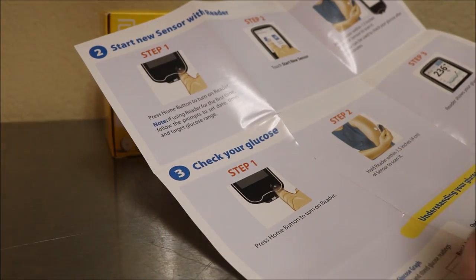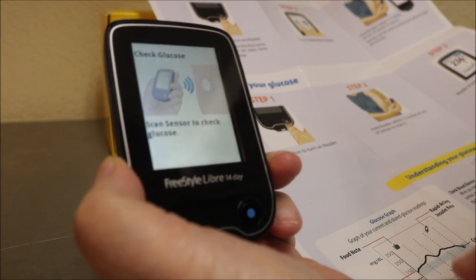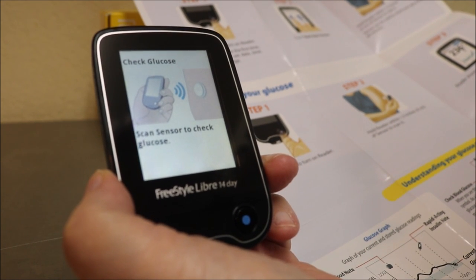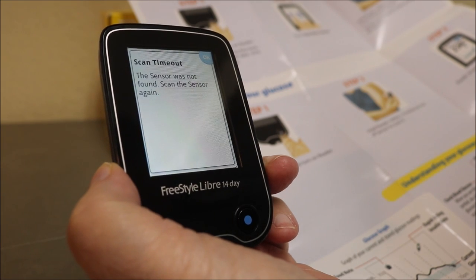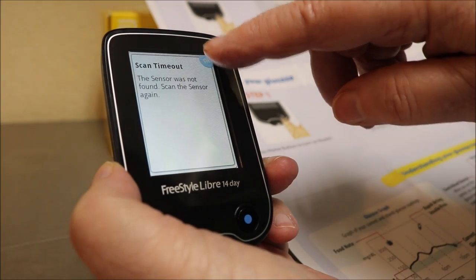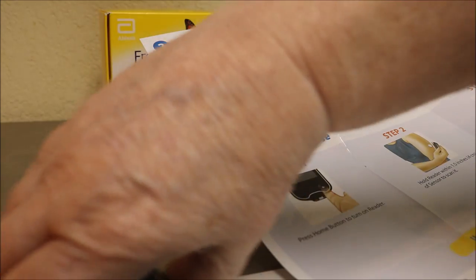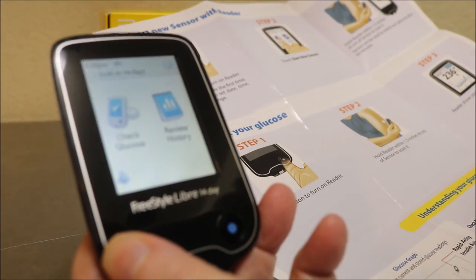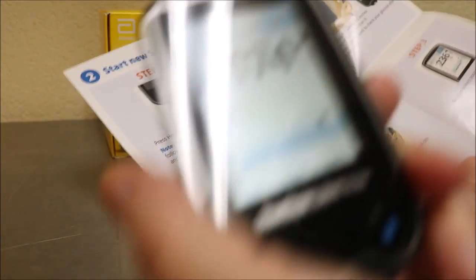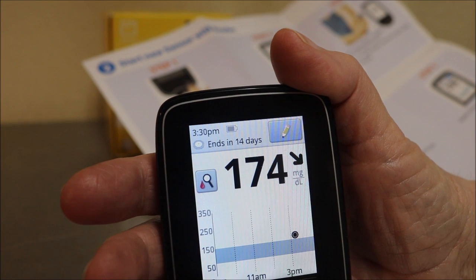Step one: turn it on. Scan — hold the reader within one and a half inches of the sensor to scan it. I turned away because I didn't do it fast enough, but that's okay. You can do this through your jacket, sweater, or pajamas. Check glucose — and here we go: 174.